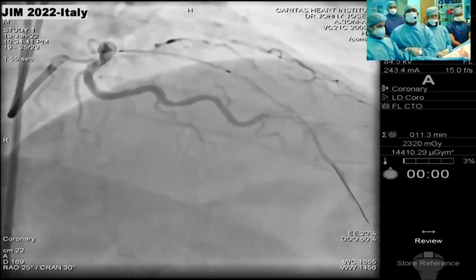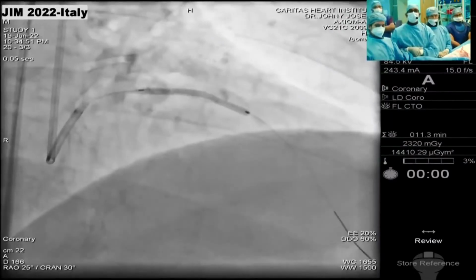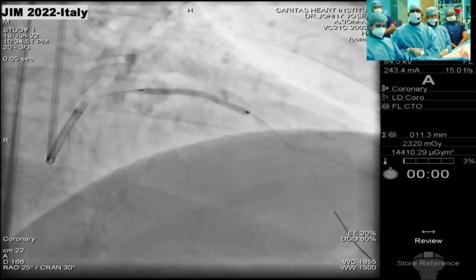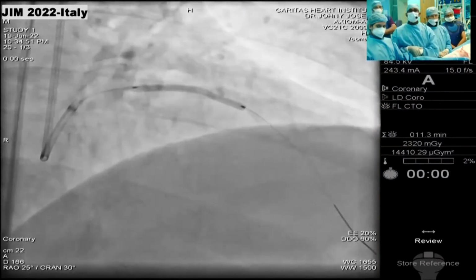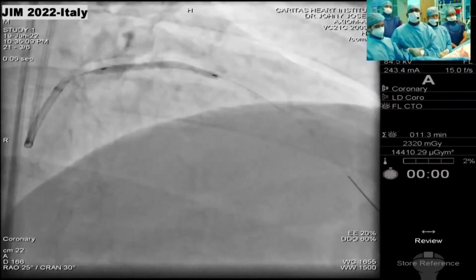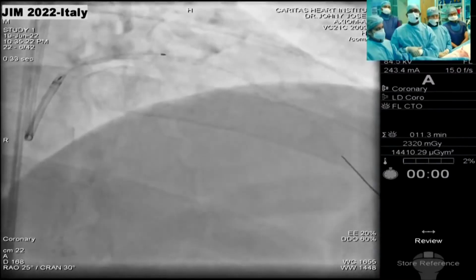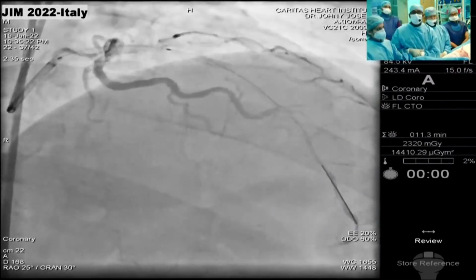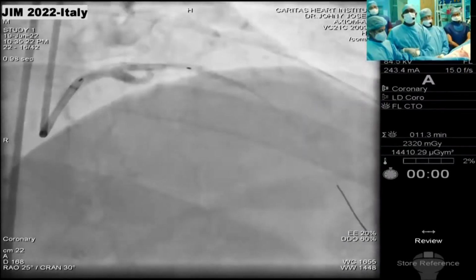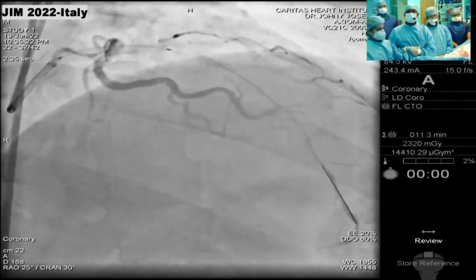2.75 millimeter Alpine. Next image, we went up at 12 atmospheres. We deployed the stent at 12 atmospheres, pulled the balloon back a couple of millimeters, and went up to 16, 18 atmospheres. That's the result that we could achieve. We definitely have in our mind that we would go ahead with a 3 millimeter balloon for post dilatation at high pressures inside the LAD stent.